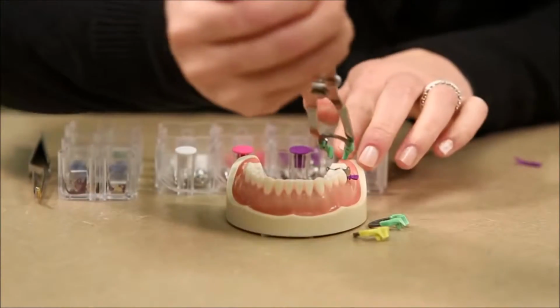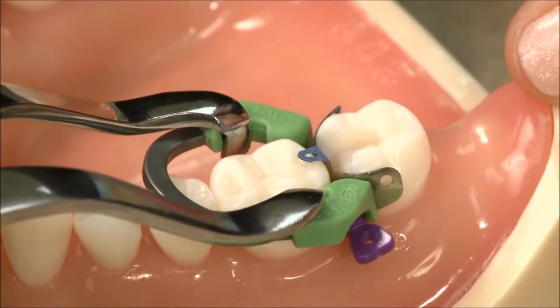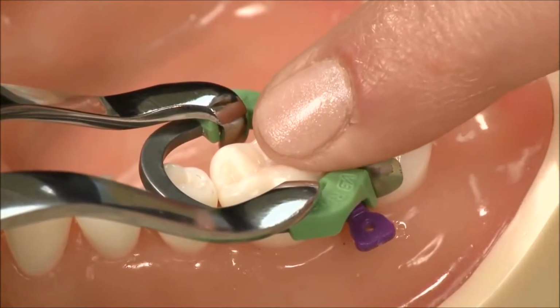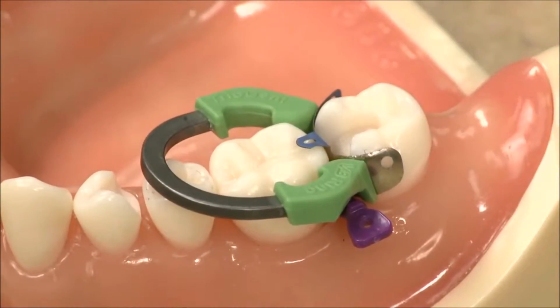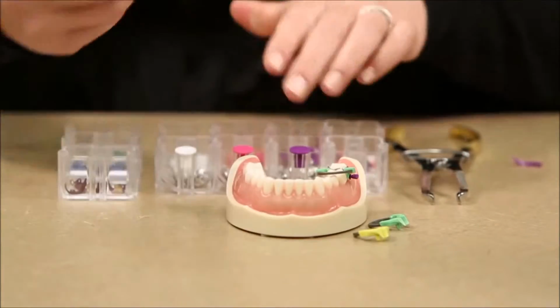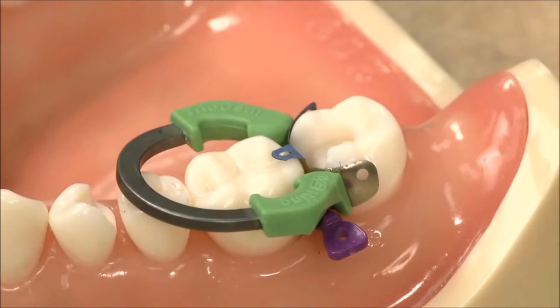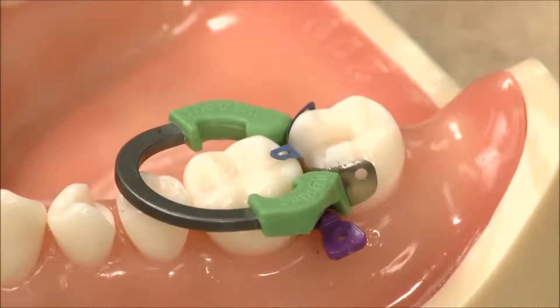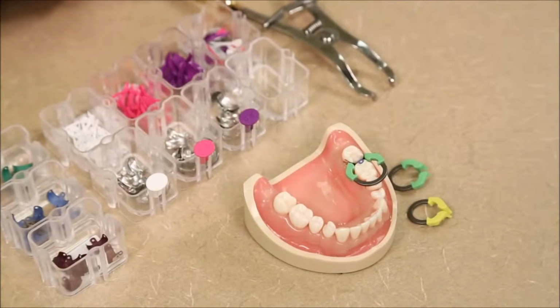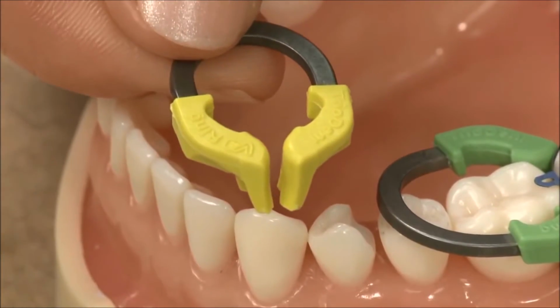When I place this, I'm going to put it right up against the band and rock it on top of the wedge. And I always put a finger here before I remove it just to make sure I have it seated properly. Then I'll do a light burnish on this. We do recommend only a light burnish. And when that ring is in place, you're actually getting 60 to 80 microns of separation with only a 35 micron band. The yellow ring in this system is called our narrow ring.